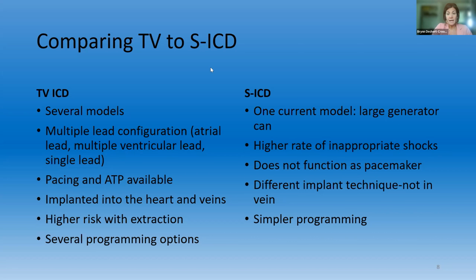There is a different implant technique. It's not in the vein, it goes in the axilla, and it's very simple programming. So it has the ability to do what it needs to do, which is shock, but again, no pacing or anything like that.